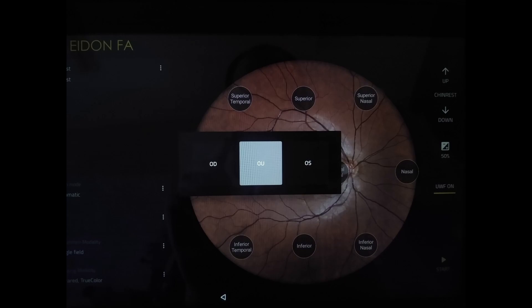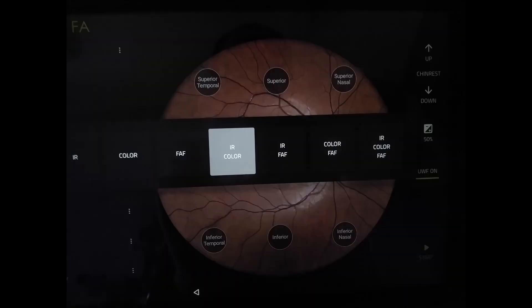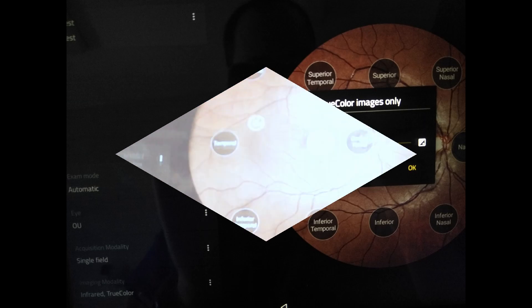You can take single field, multiple fields, mosaic, horizontal, vertical, full, or a 3D stereo image. All images can be taken as infrared, color, autofluorescence, or a mixture of these three. On this panel you can also change the chin rest height and exposure — 40 to 140 percent, predefined at 50.